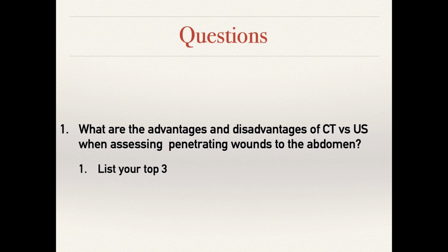Ultrasound, however, has no radiation involved. You can reproduce the exam many times. You can repeat the exam as needed. It's almost a perfect test for evaluating for pericardial effusions and penetrating trauma. And it's good for seeing intra-abdominal blood, but it's very bad at seeing what the exact injury is. Ultrasound can also be done at the bedside, so you do not need to take an unstable patient to the CT scanner.